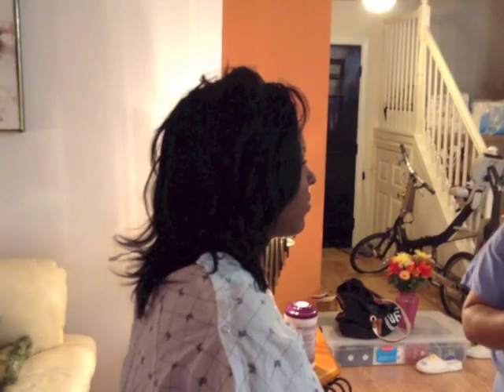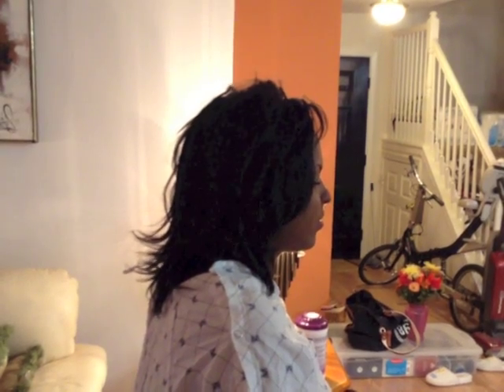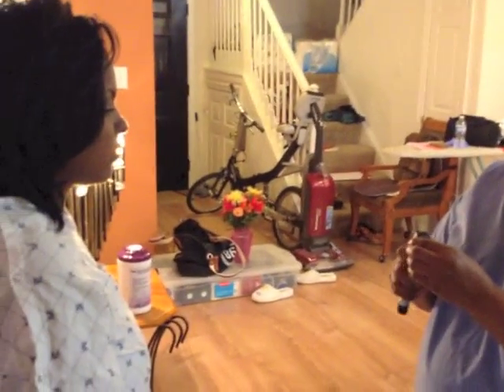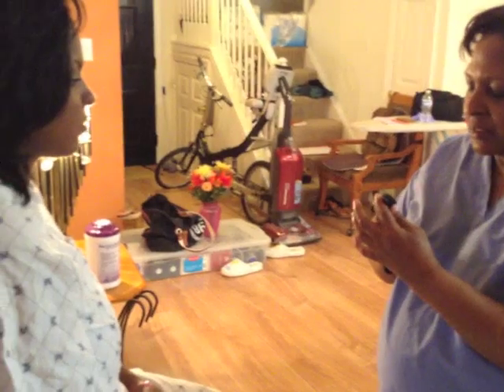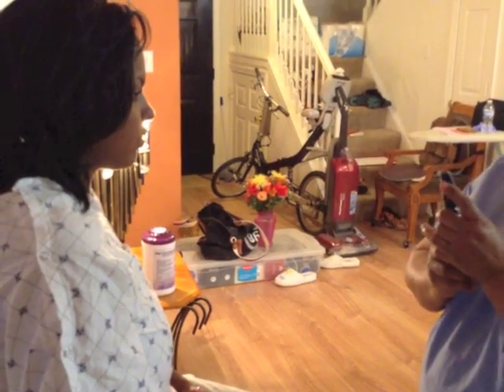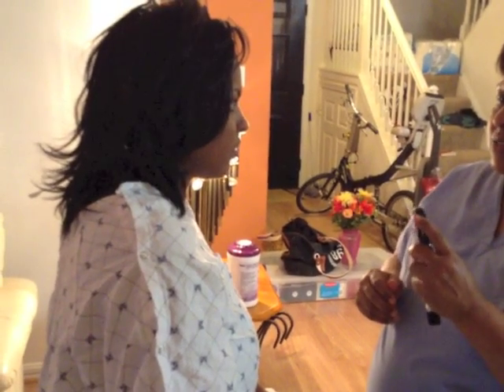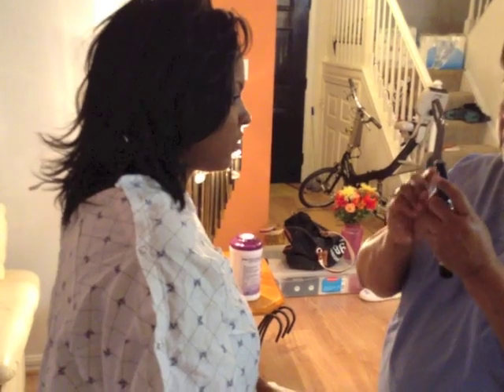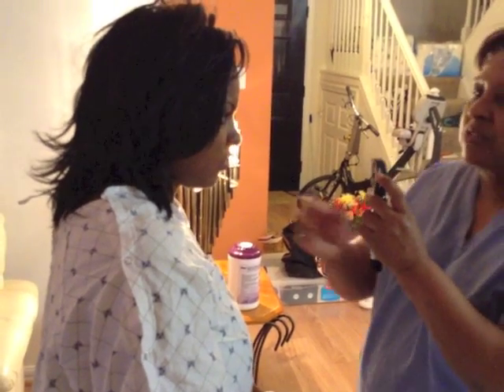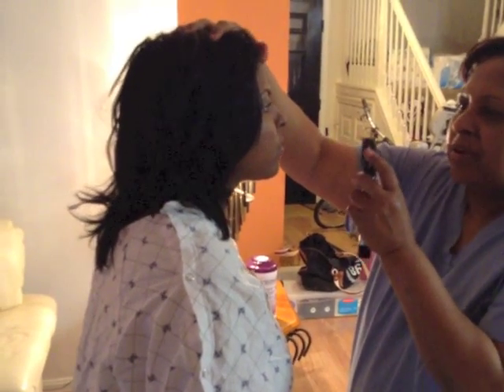Now I'm going to use an ophthalmoscope, and I'm going to examine your eyes with the brightest light. It seems like my light is gone. The brightest light I have. So I'm going to look for light accommodation and structure. I'm adjusting it to the highest setting. It seems like my light is not working well. So what I want you to do is keep your head up straight, okay? And I'm going to hold your head, and I'm going to look into your eyes.